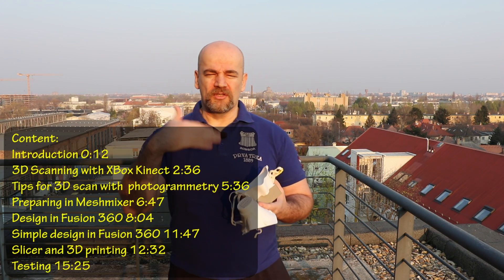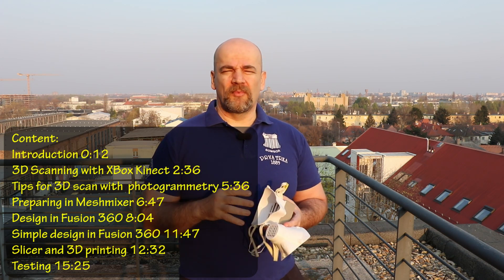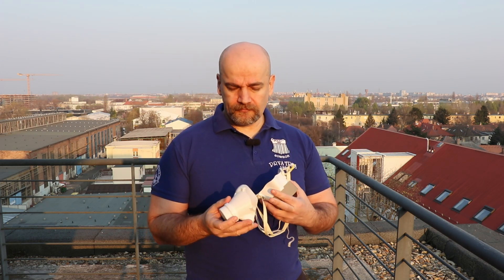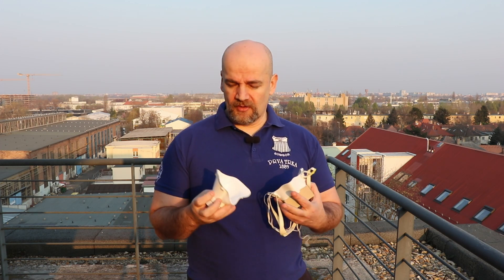Here you can see the contents so you can jump to any part you'd like. First I'll talk about 3D scanning — I'm using an Xbox Kinect, but I'll give tips if you want to try photogrammetry by taking photos and stitching them together. In the second part I prepare the surface using Meshmixer, which is also free software. In the third part I use that surface in Fusion 360 to design the mask. I'll show two designs: one is a bit overkill, but I'll also show a much simpler approach.